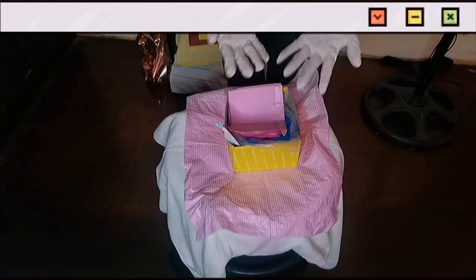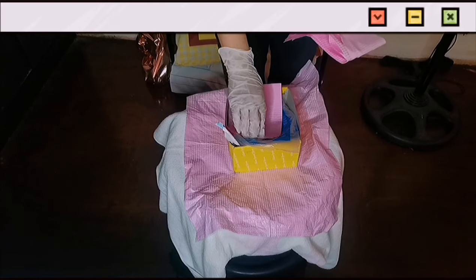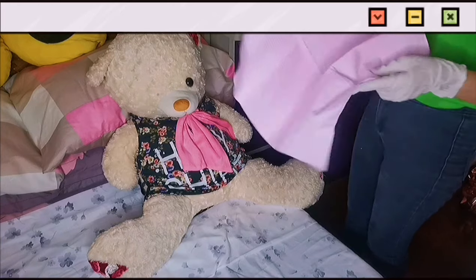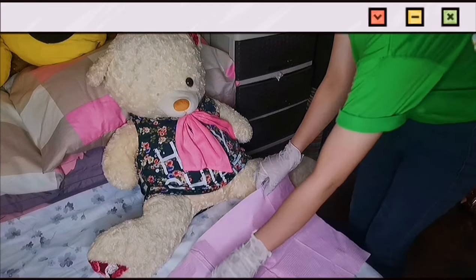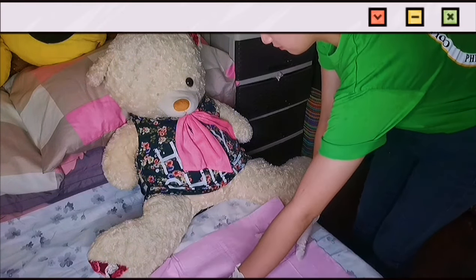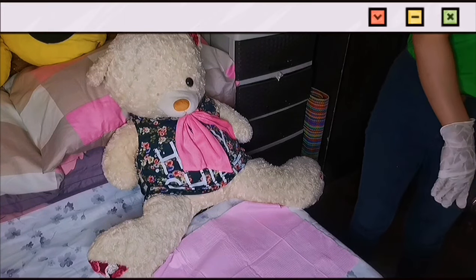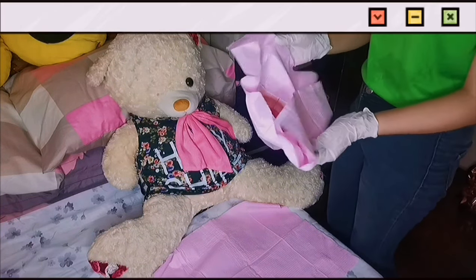Now I already have the sterile glove on, so I can touch the items inside the kit. This is the drape — one is placed underneath the patient's thighs, and one is for exposing only the genitalia of the patient. The first drape goes underneath the patient. Make sure not to touch anything that is not sterile. The next drape is placed around the genitalia of the patient, exposing only the vagina.